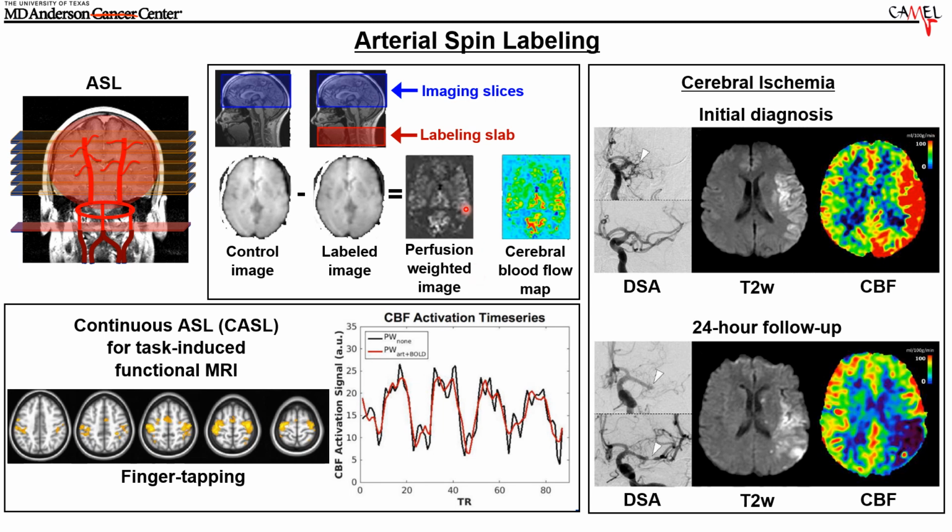That's how you can get perfusion weighted imaging and cerebral blood flow maps in this way. Here is continuous arterial spin labeling, also known as CASL, where a patient was tapping with their finger on and off and on and off. And you can see that there was a stimulation of flow into certain areas of the brain due to that finger tapping. And then you can see these areas are where the finger tapping had the flow changed the most. So by comparing this with the previous functional MRI methodology, you can see different types of brain function.